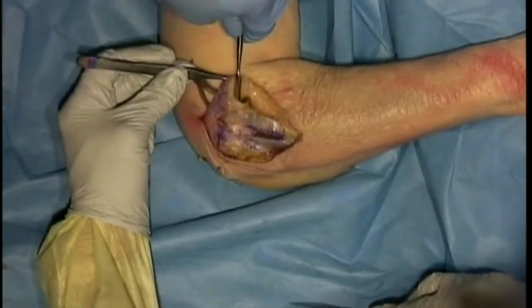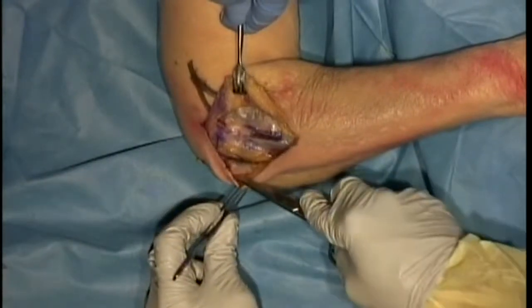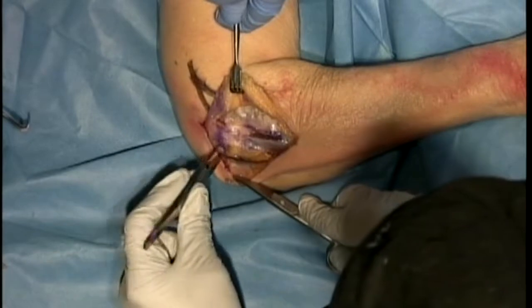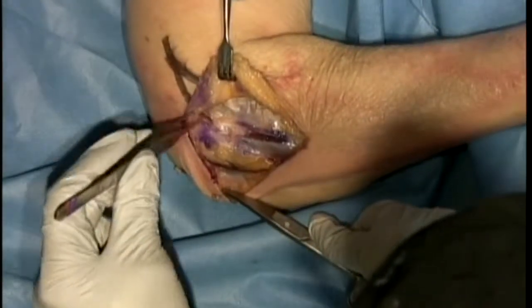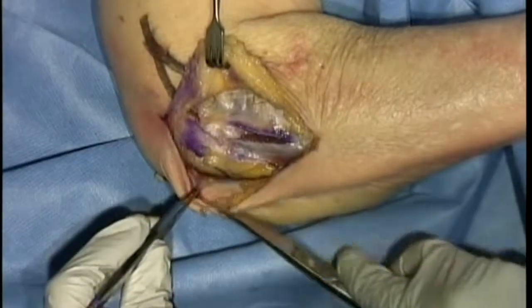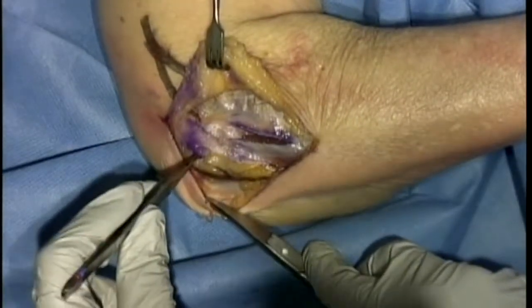So Hans, I'll get you up in there. So down here, I've marked off the medial epicondyle right here. Sorry, lateral epicondyle. Thank you very much, Michael. Yeah, seniors. So lateral epicondyle here.